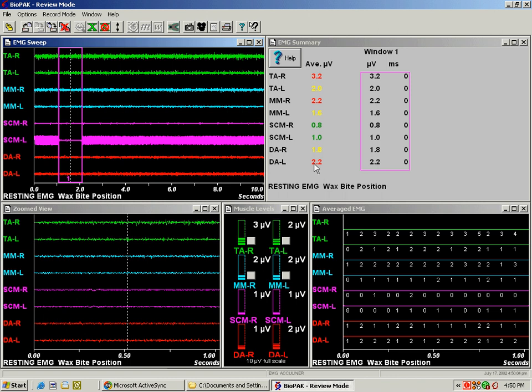Now these microvolt settings are changeable. If the clinician believes that 2 microvolts is normal resting activity or 3, you can change the thresholds that change the colors here in this display so that green will indicate to your clinician normal, yellow would be a borderline condition, and red would be considered hyperactive.